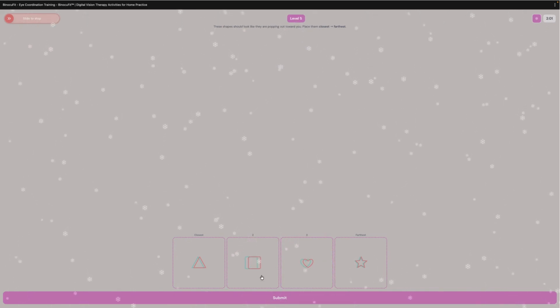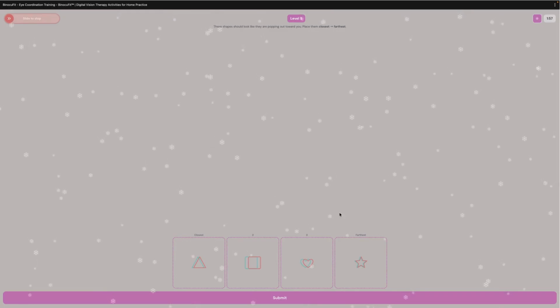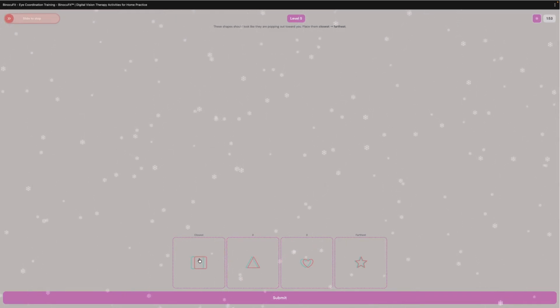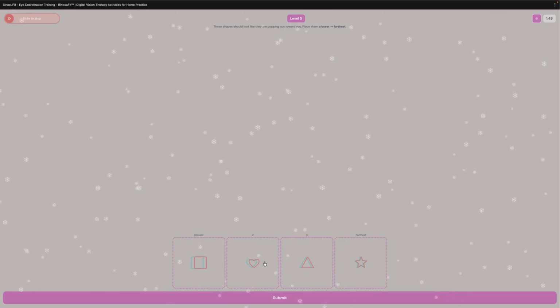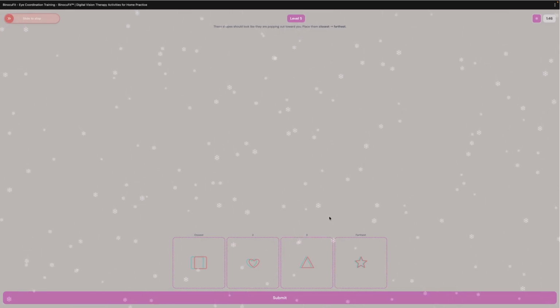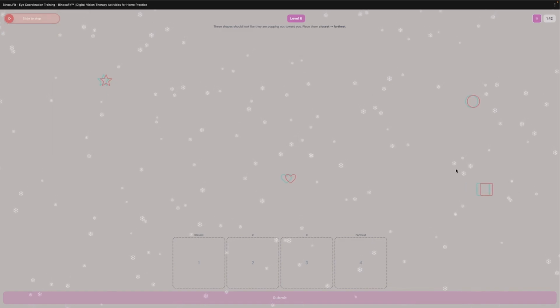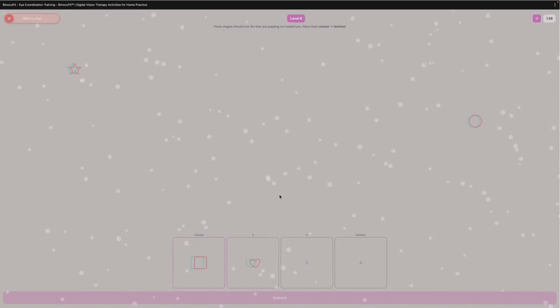How efficiently are we working through this? It's a lot more about developing that precision than it is about just, can you see it popping? Where is it? Just localizing a random object, whether you can identify it or not. Here we're actually making decisions about how to interact with them.